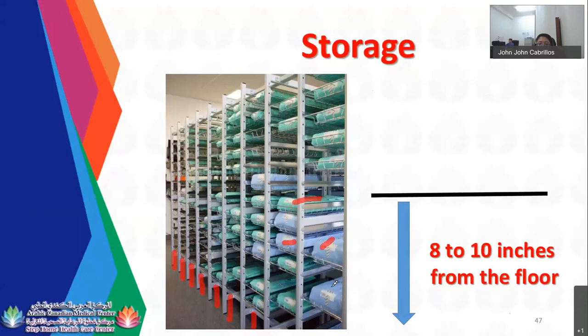So when you are removing packages or sterile container or rigid container here on the shelf, you are not allowed to drag any instruments or packages. You need to lift it and drag, okay? Not automatically drag it. So lift and drag. So that's the protocol in sterile storage.